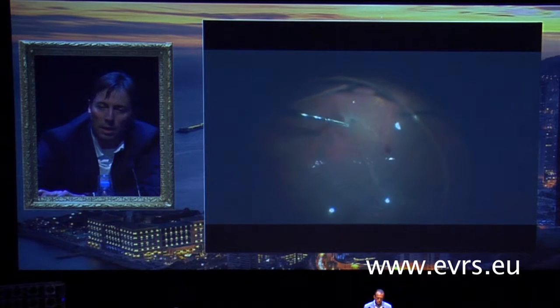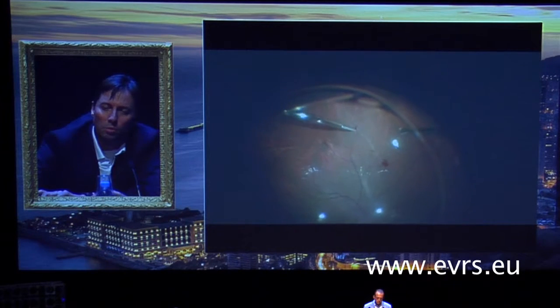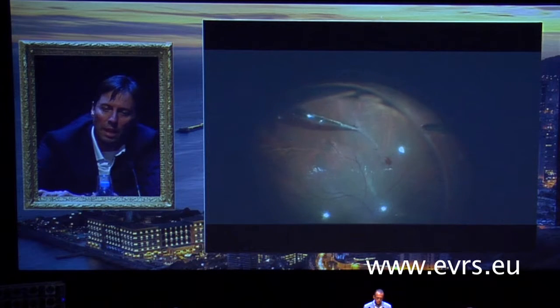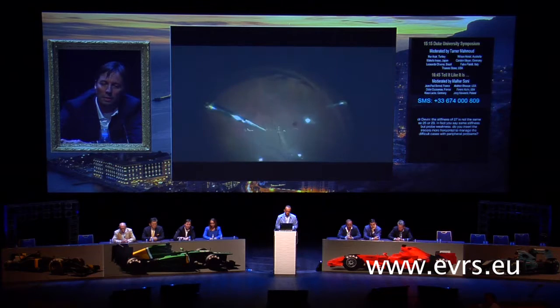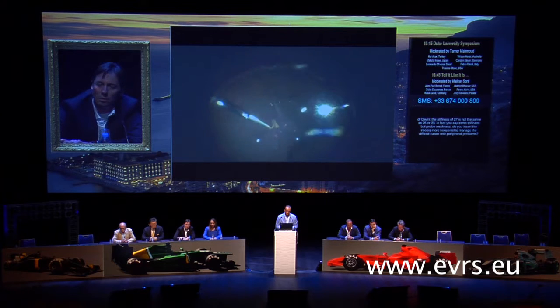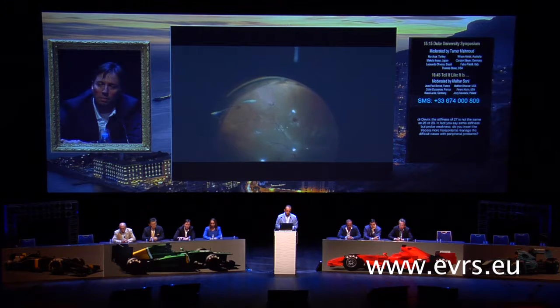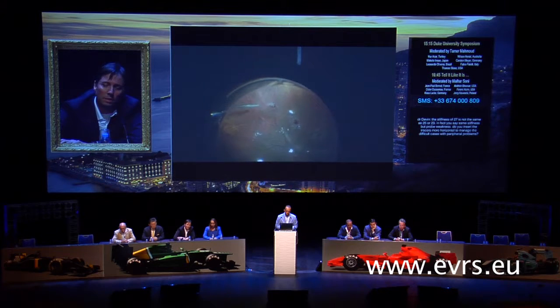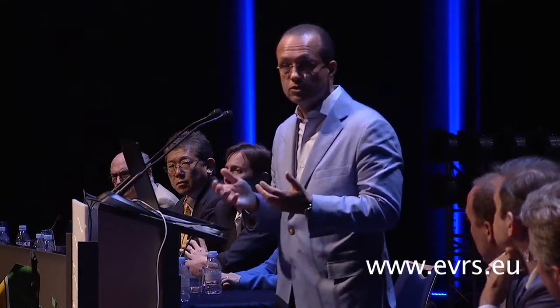So we do the same. And you see I did the first retinotomy, the PVR just contracted sideways, and you have to do it to take it all. So at the end, we put laser around the retinotomies. This technique would avoid large retinectomies and extensive manipulation. So this is great. Let's just open it to the panel and see what their preference is for treating subretinal PVR.